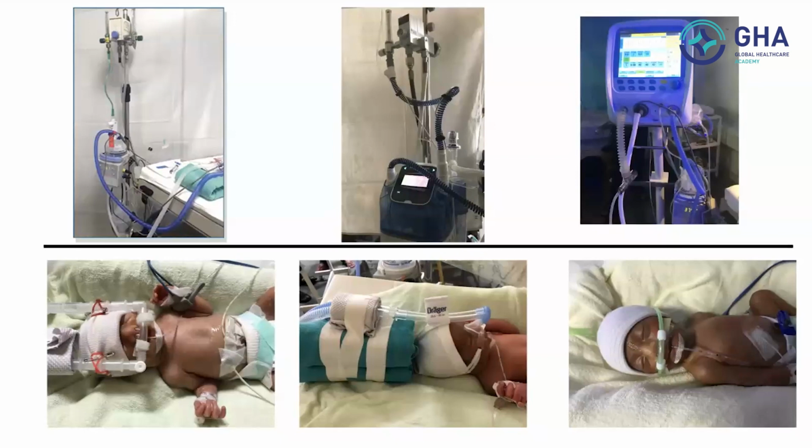So we started initially with the ET, that is a nasopharyngeal tube. Then we shifted over to binasal prongs, that is Hudson prongs. And of late, we are using the Ram's cannula because of the ease of use and also Drager mask CPAP. We use in our unit Drager mask CPAP for less than 1 kg and more than 1 kg, we use Ram's cannula CPAP. But when you're giving Ram's cannula CPAP, ensure that there is some amount of leak around the nostrils. Whereas in all other CPAP, the CPAP interface should fit snugly on the nostrils.